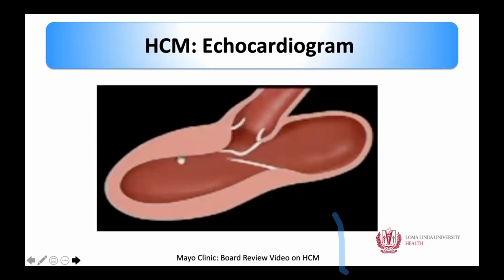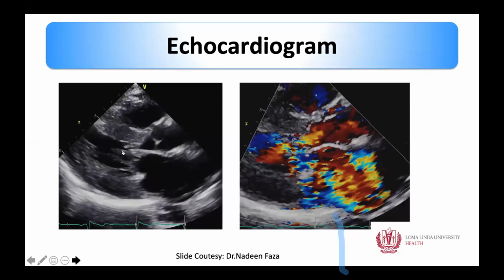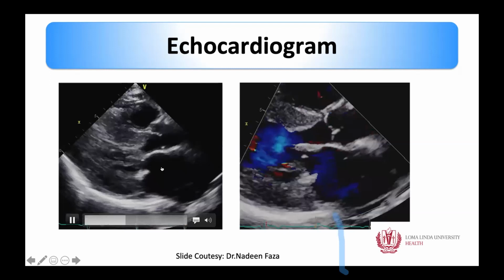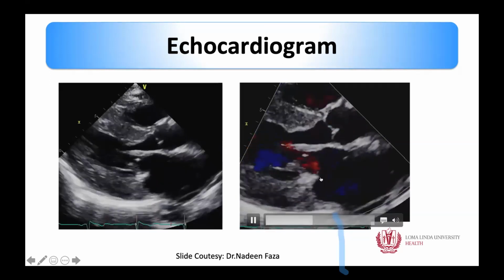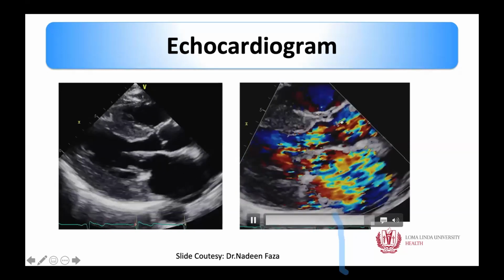So this is an example of an HCM patient. You can see there is florid, quite prominent, severe SAM, and that SAM leads to this posteriorly directed mitral regurgitation, and then there is LVOT obstruction. This is how a classic patient with obstruction will present.